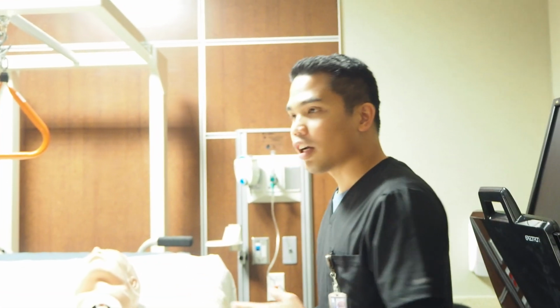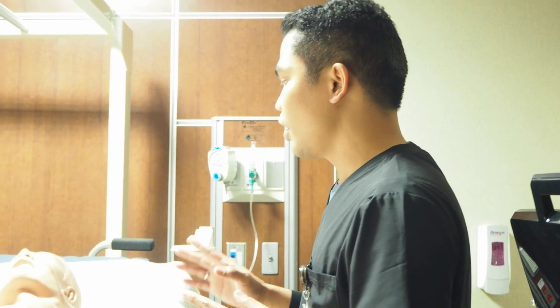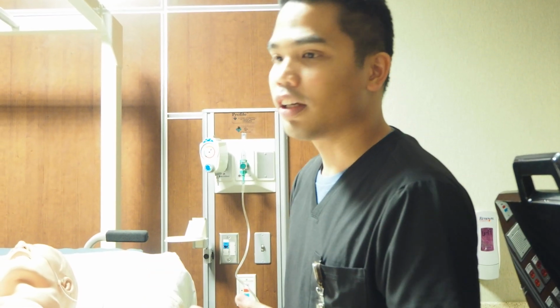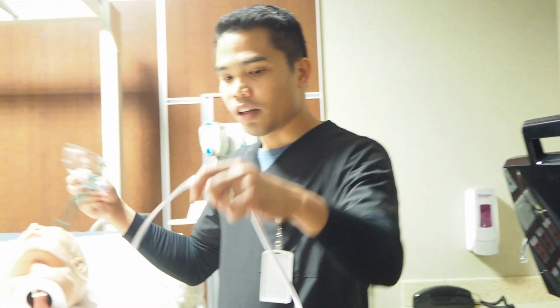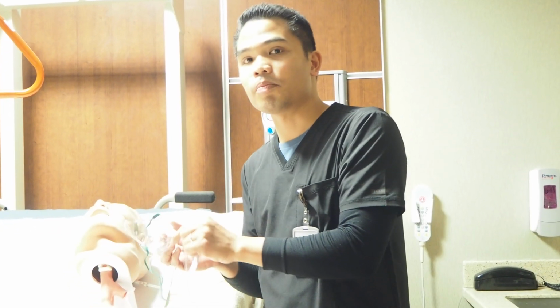So right now I'm here reassessing the patient on the nasal cannula at 3 liters. I observe that the patient is still distressed, with the SpO2 still in that range of 88% to 90%, and is also lethargic. When I assess the patient, they're still unresponsive, and their breath sounds are still kind of congested. So I recommended to the doctor to hook the patient up with a simple mask because of the patient's present situation.